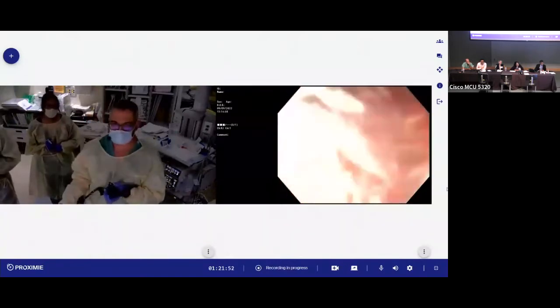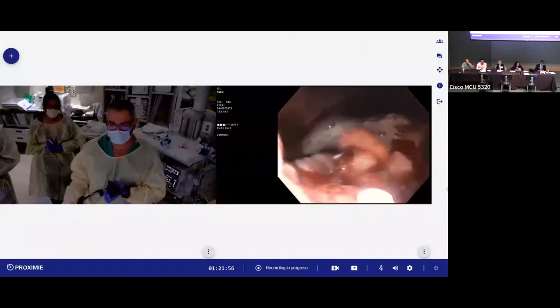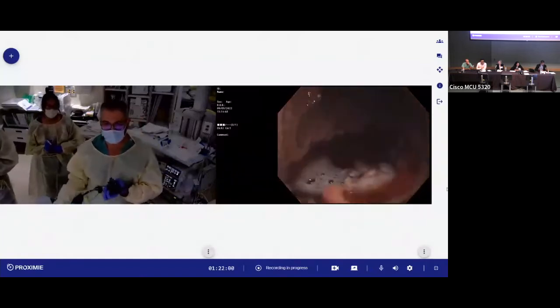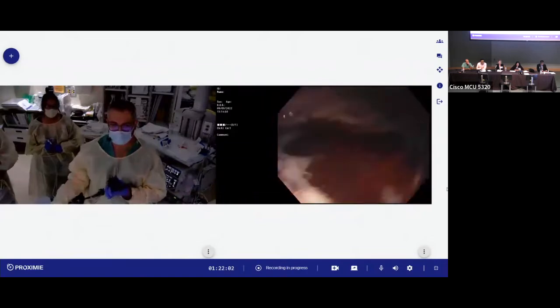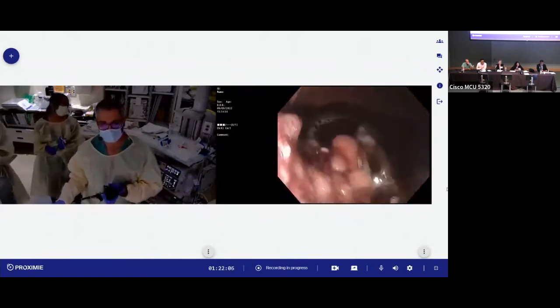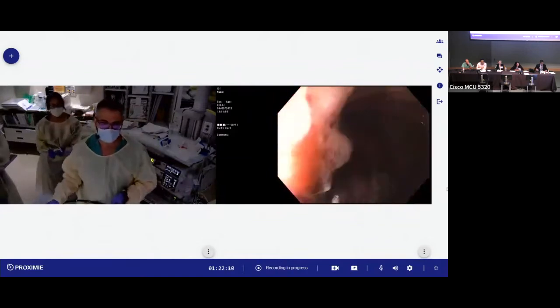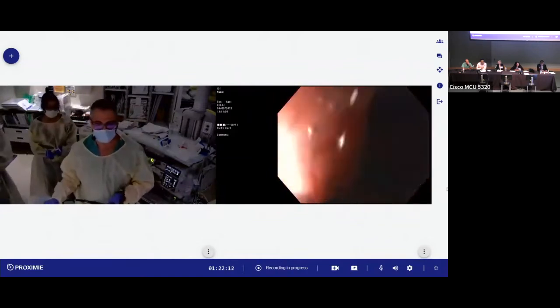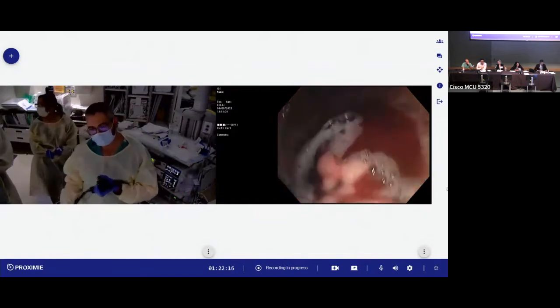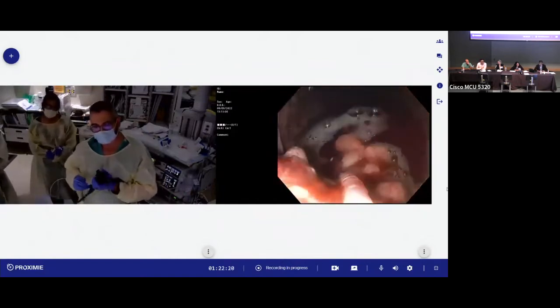Yeah, so if this was really high-grade dysplasia, this technique wouldn't be enough. But what I'm seeing here is inflammatory polyp, and I saw other inflammatory polyps. And I had the situation before that these polyps could look like low-grade adenoma when they are that large. And even if it is low-grade adenoma and we don't have a sign of cancer, we can do a piecemeal. But definitely, if this is positive for cancer, he will have to go for surgery.